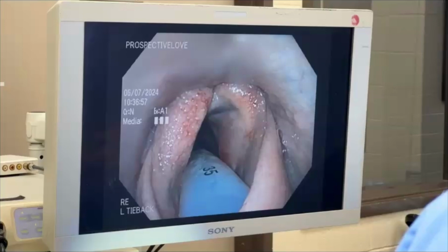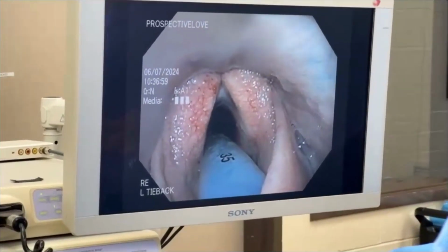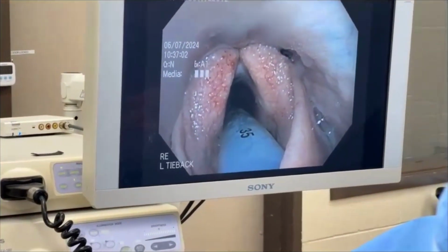We try to pull it out of the airway to maybe about 70 to 80% of what is maximum. A normal horse that's breathing hard would be able to pull that arytenoid up and out of the airway farther than that. But we don't want to do that because those horses post-operatively would have problems with coughing and aspirating. So we pull it out to around 70, 75% of what's maximum. We know that over the next couple of days, we're probably going to lose a little bit of that.